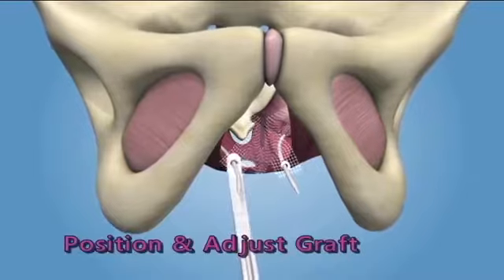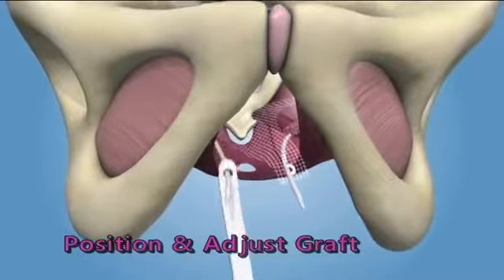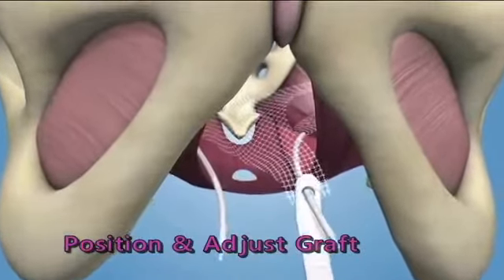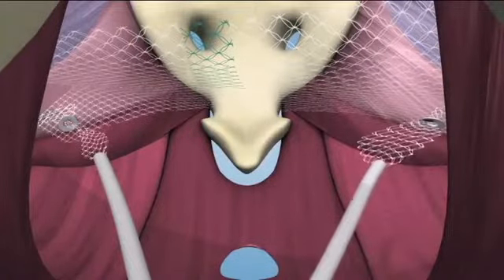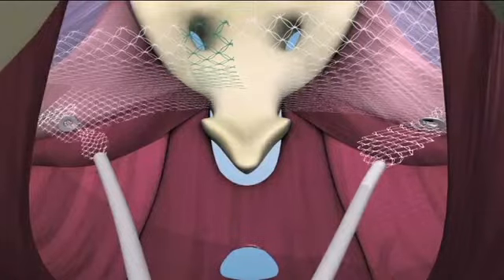Position and adjust graft. To position the graft, insert the end of either fixation arm through tip of the adjustment tool. Hold the apical fixation arm medially within the introitus and slide adjustment tool down the apical fixation arm toward the graft, pushing into the pelvic cavity. Slide the graft body down the apical fixation arms until the desired position is obtained.